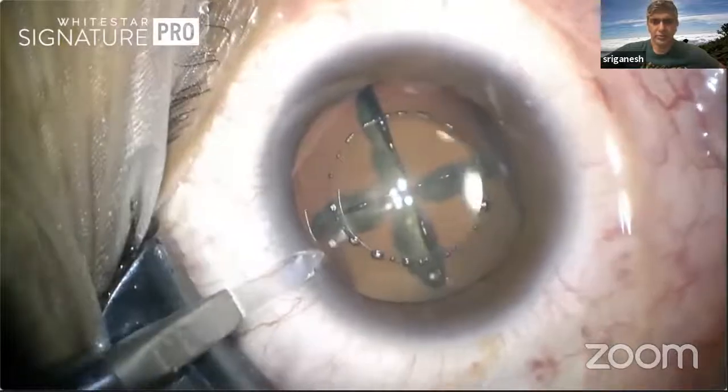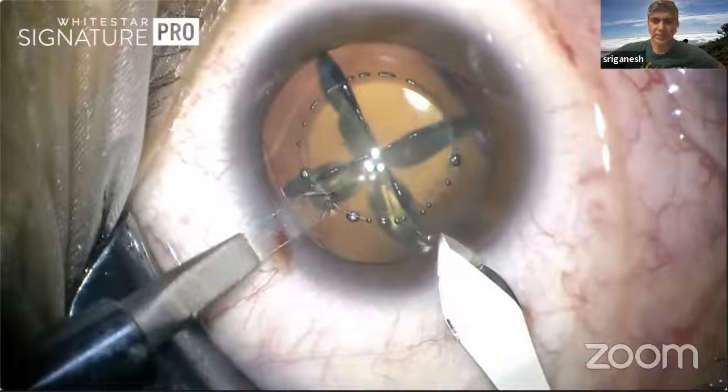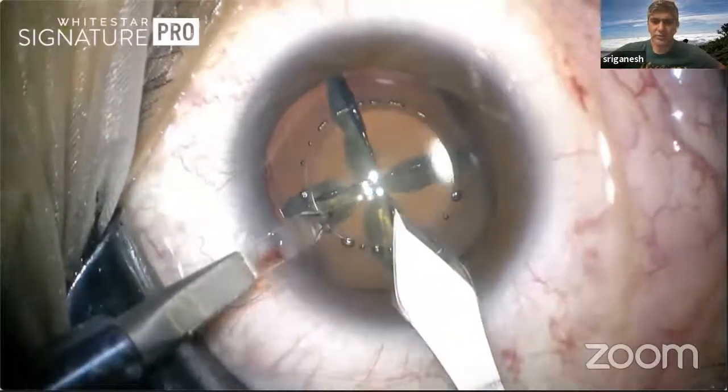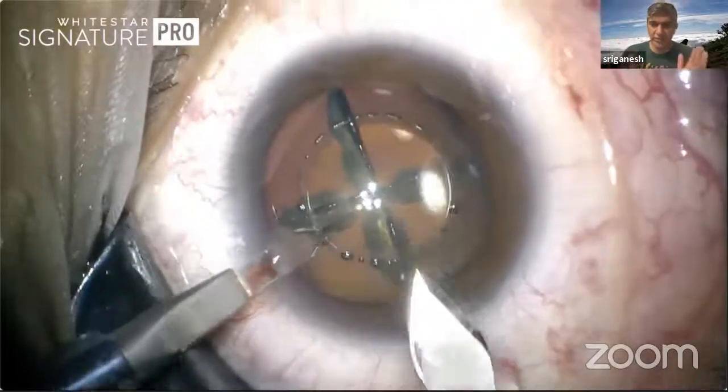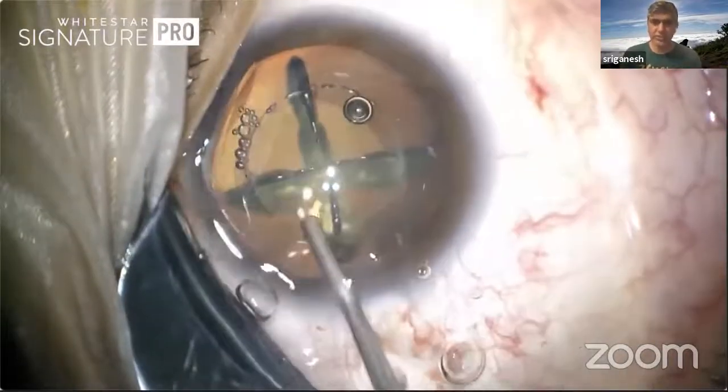I make a side port 1 mm incision and a 2.8 mm incision. This is again a trapezoid incision. So when you make a funnel shaped trapezoid incision where the inner lip is slightly large, about 3 mm, then it's very easy to remove the lens.